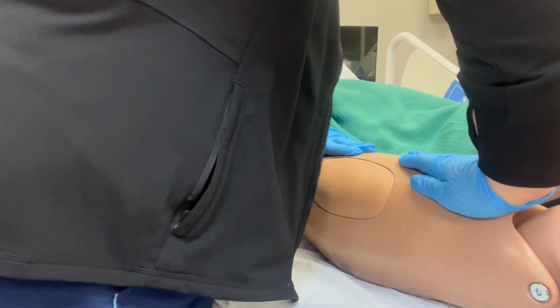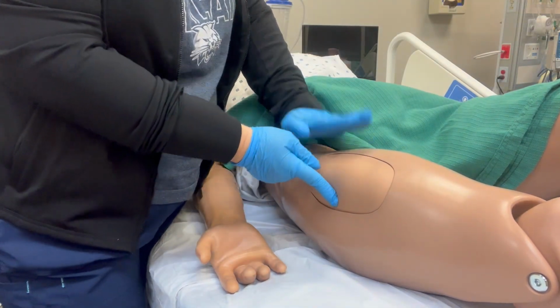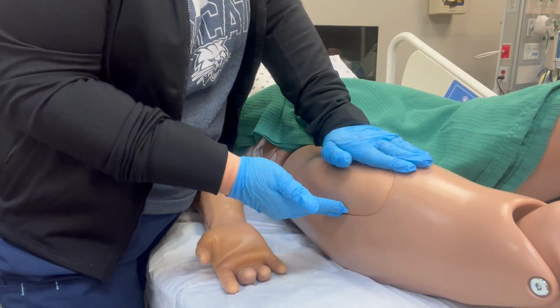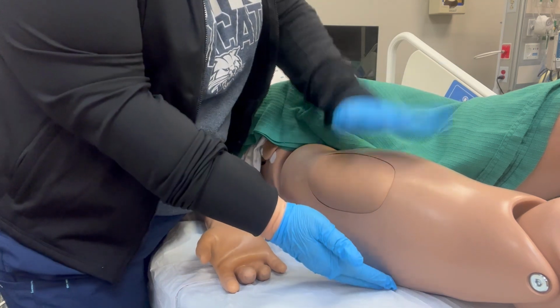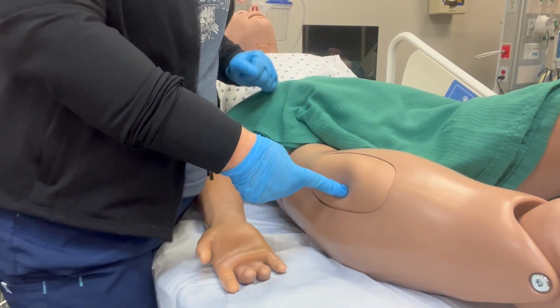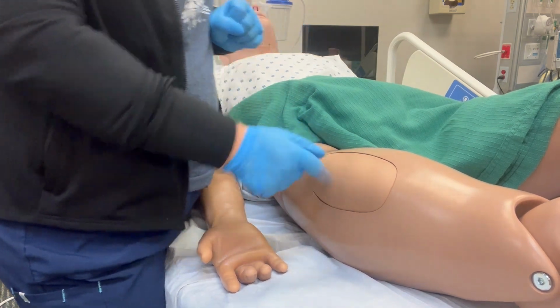And then when we find the middle, we're going to go to the side, and then top, bottom, middle, right? So this is the top of the thigh, this is the bottom of the thigh, and we're going right in the middle. And that would be our vastus lateralis.